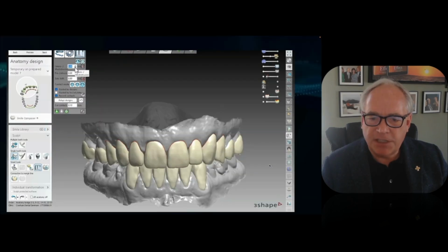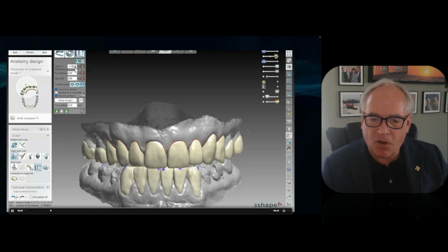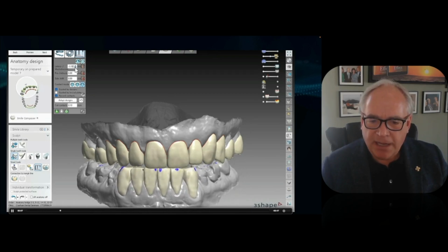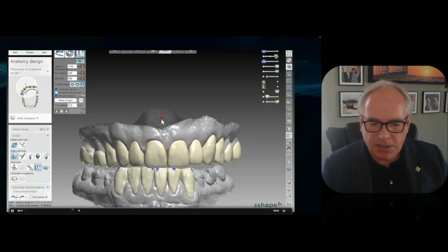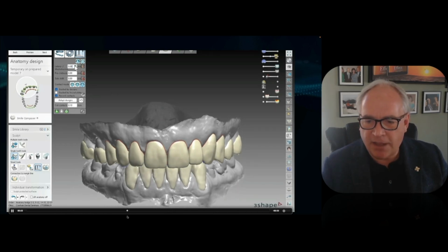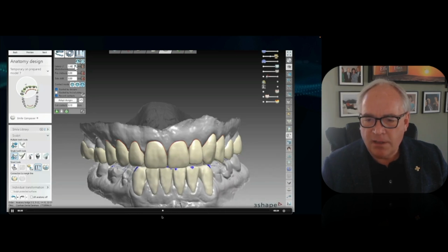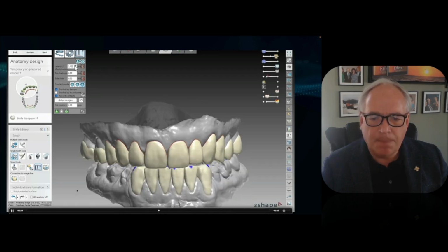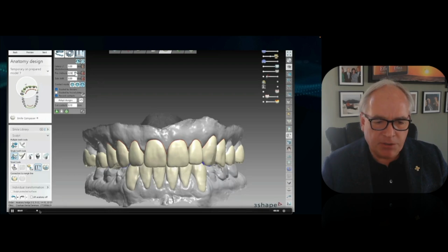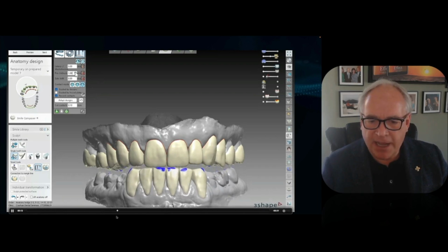And then we can even see specific things like crossover, where the lower canine crosses over the upper canine and how it misses the lateral and transitions right to the central. This is what we want to see. Looking at it the other way, lower canine crossing over the upper canine and landing on the central, skipping over that lateral. Similarly in protrusive, smooth protrusive path, out edge to edge.